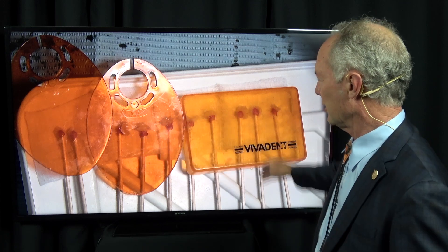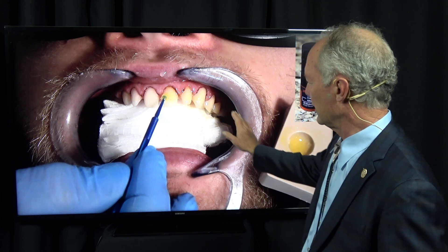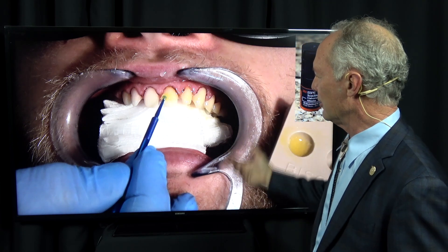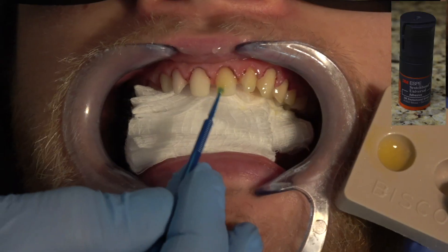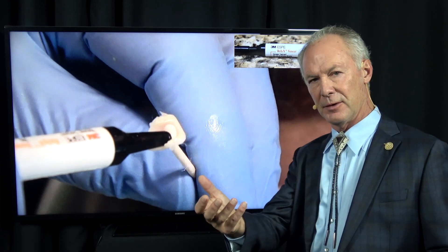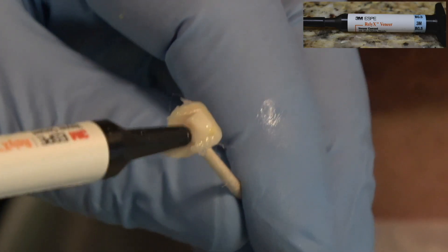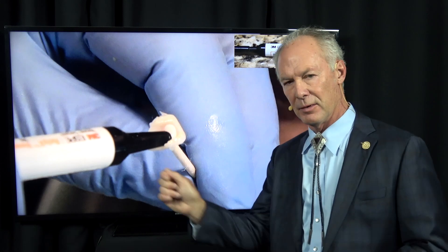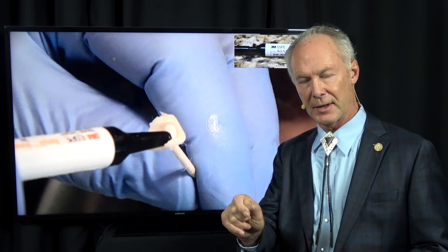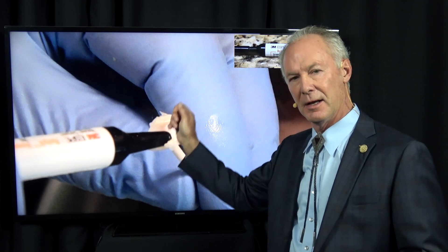Then put them under orange covers to prevent them from curing. Then place the primer adhesive on the teeth with a copious amount — really soak them — and blow it off onto a two-by-two. Always place the two-by-two on the tooth when blowing it off so it doesn't get all over the tissue. I've already placed primer adhesive on the tooth side of the veneer and blown it off until nothing wiggles. I've done the same thing on the teeth.